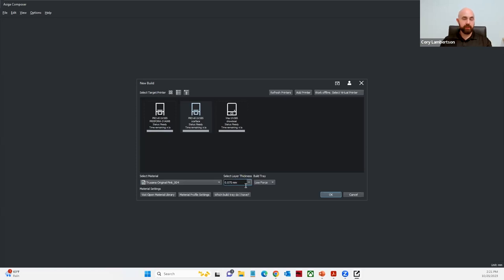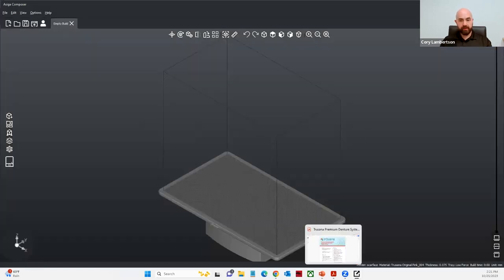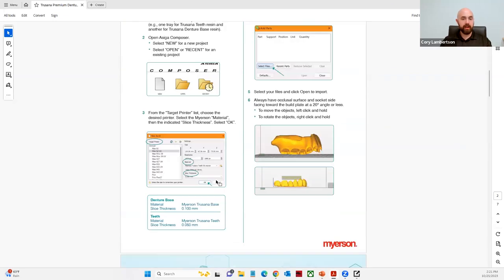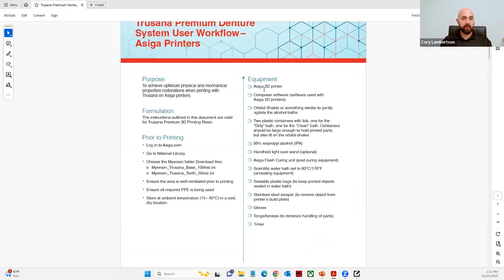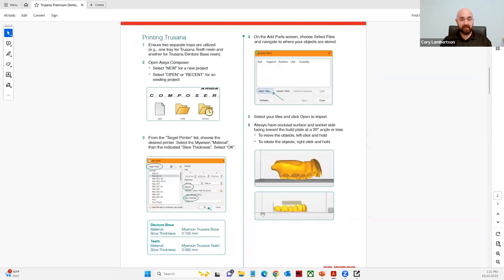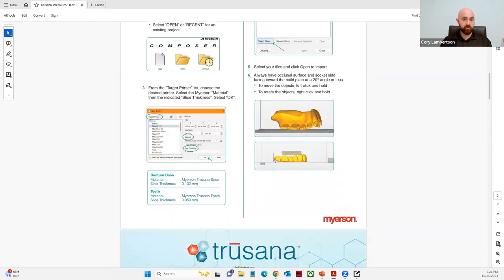Then you'll choose what layer thickness. The engineers found that printing at 75-micron layers yields the best results for the Trusana denture base resin. We're going to keep it at 75 microns, and if we're printing on the Pro 4K, we're going to want to use the low-force tray. I also want to point out that Trusana has an excellent guide covering how to set up the printer, what equipment you need, what protection you need when handling the materials, and the nesting techniques for both the denture base and denture tooth resin.